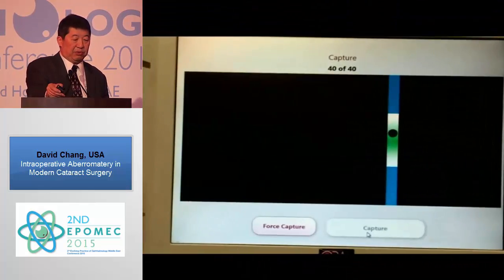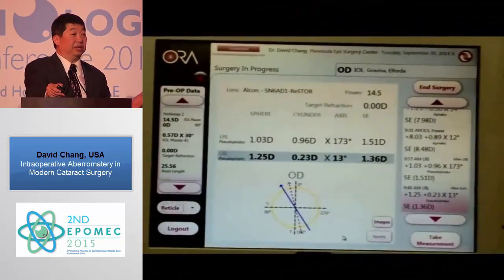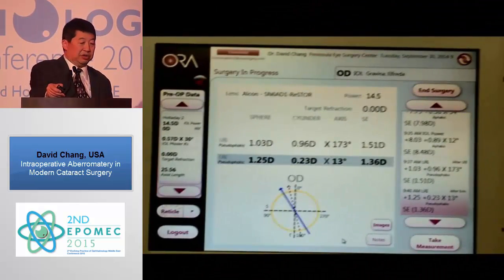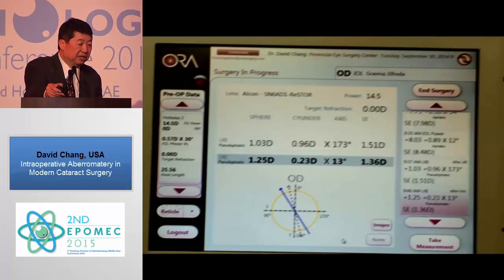And let's see what we've got now. And the winner, well, look at that. We're down to a quarter. So in this case, I'm not even going to make the second incision. So I've titrated at that. We already have a pretty good endpoint.